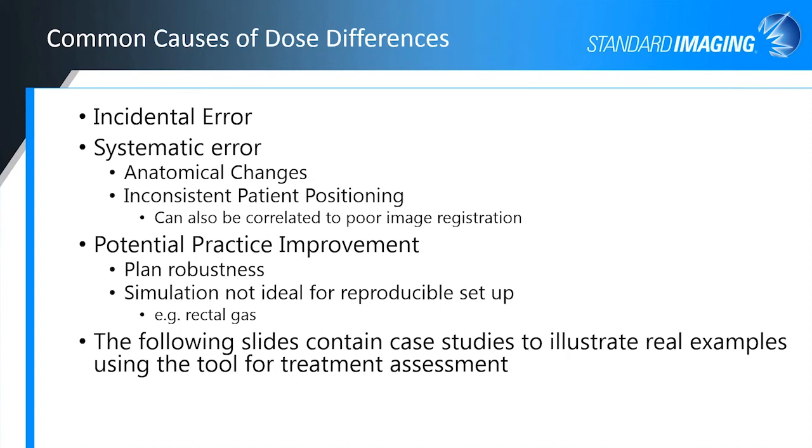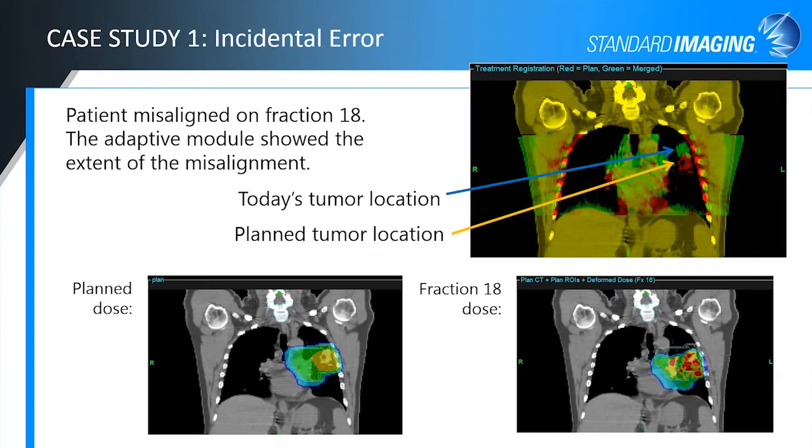So the following slides are going to contain case studies from situations in 21C that I thought were interesting and wanted to share. So the first one is an example of an incidental error.